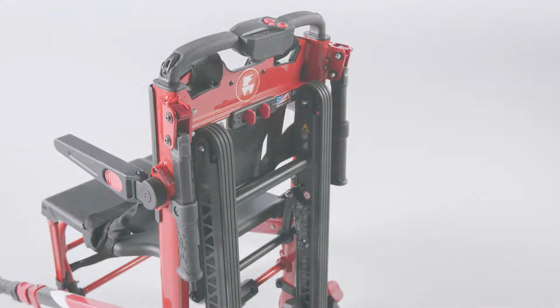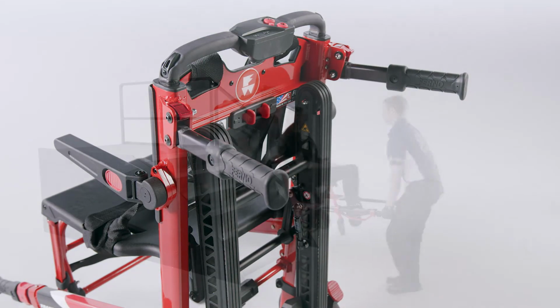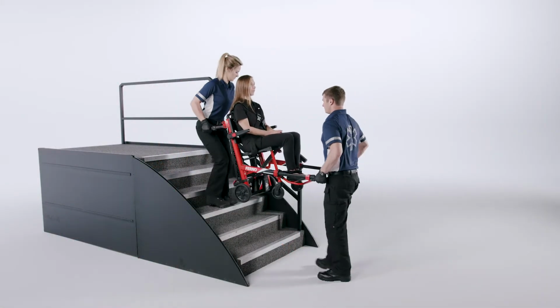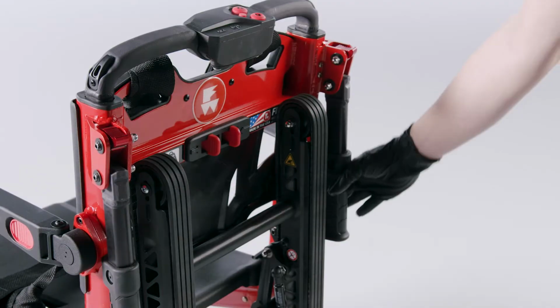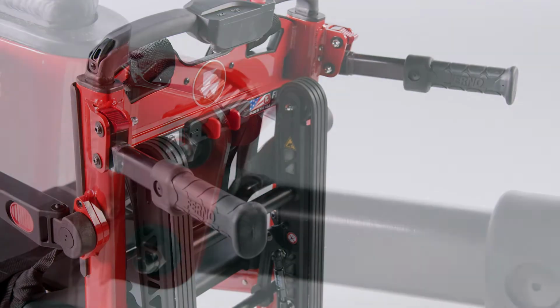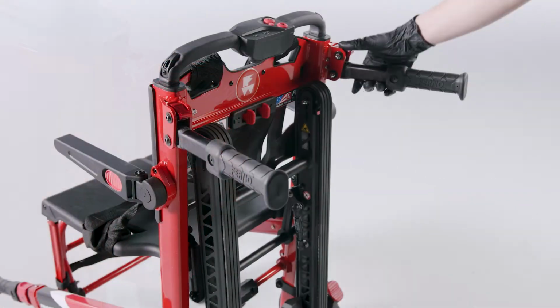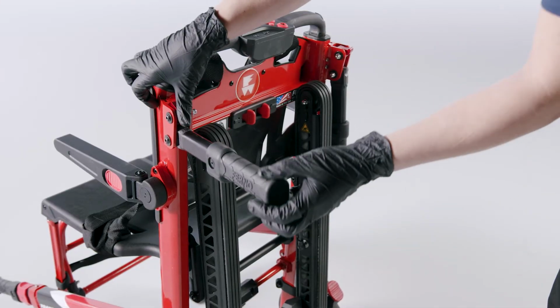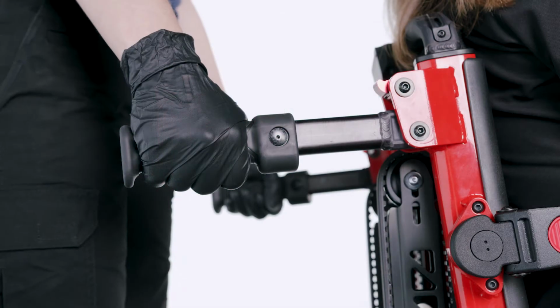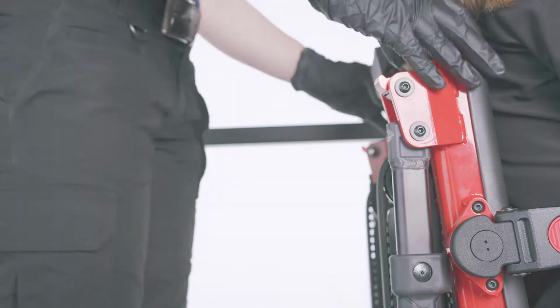The optional rear lift handles are used to guide and steer the chair when rolling, or to lift and carry the chair. To raise, lift the handle until it locks in the raised position. To lower, press the red release lever down to disengage the lock, then lower the handle. Use both handles together and keep the handles lowered when not in use.